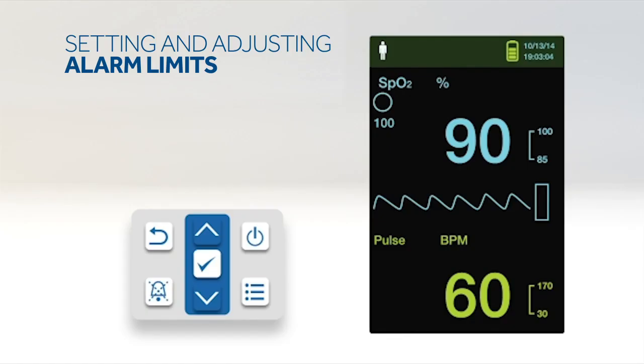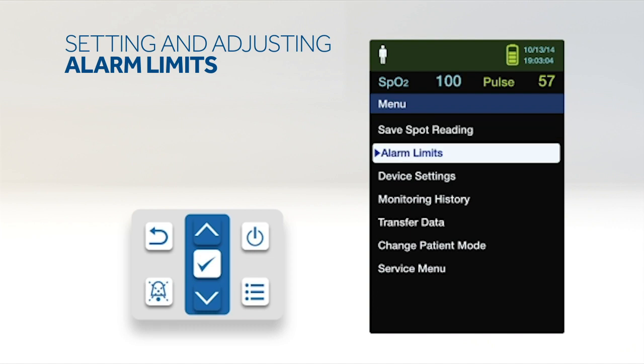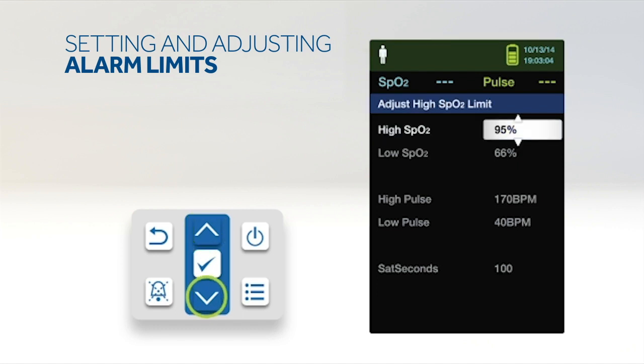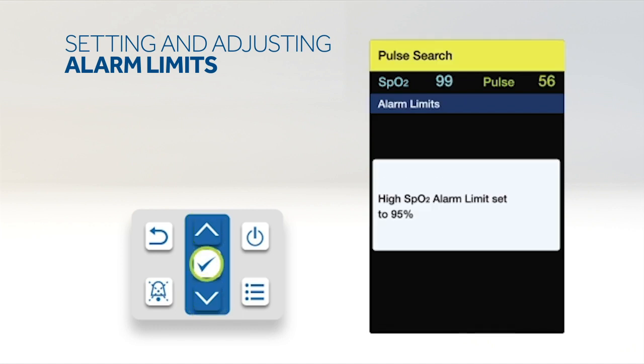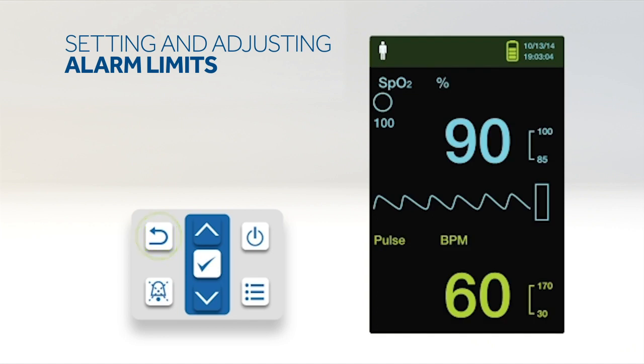To set alarm limits, press the menu button. Press the down button to highlight the alarm limits menu item and press OK to select. Alarm settings include pulse rate and SpO2 alarm limit ranges and the Nellcor SatSeconds option. Press the up or down button to highlight the desired option and press OK to select. Press up or down to change the value, then press OK to save. Press up or down to highlight another option or press return to go back to the main menu.